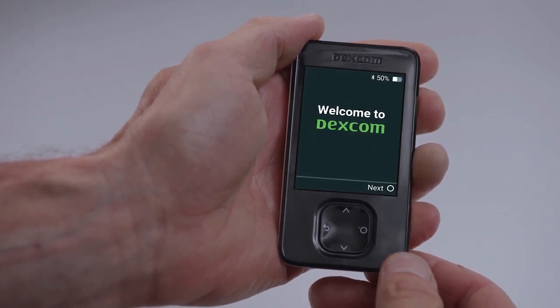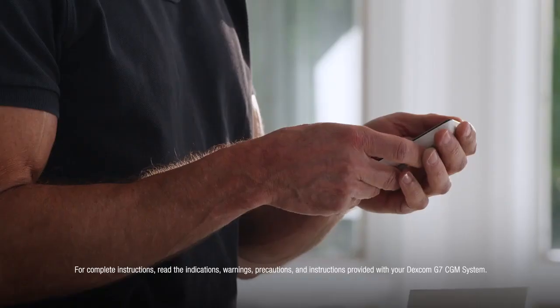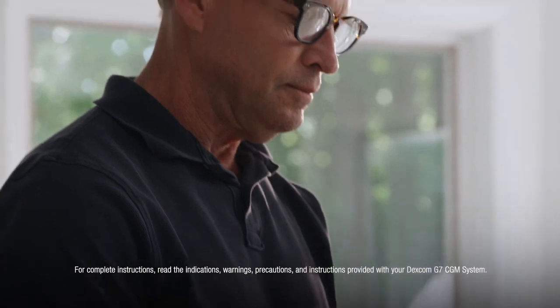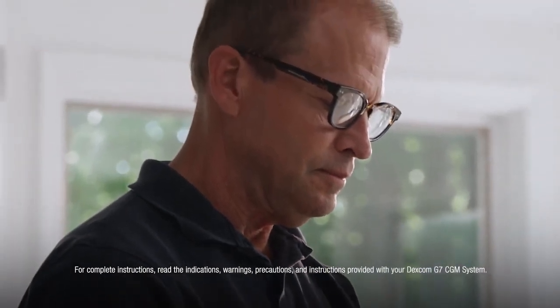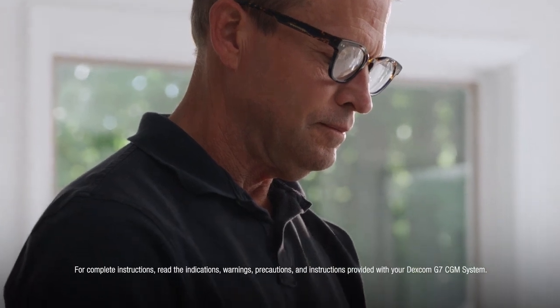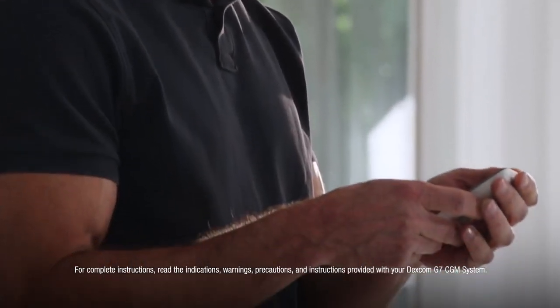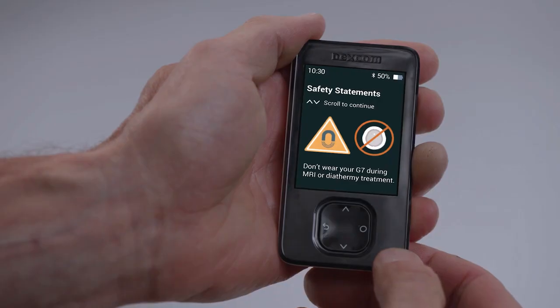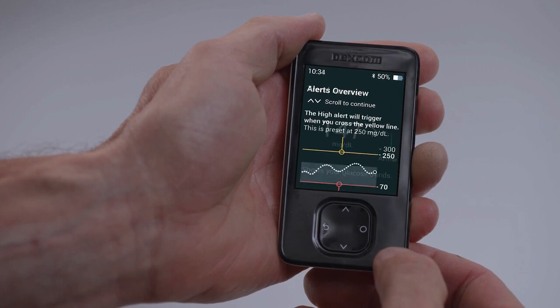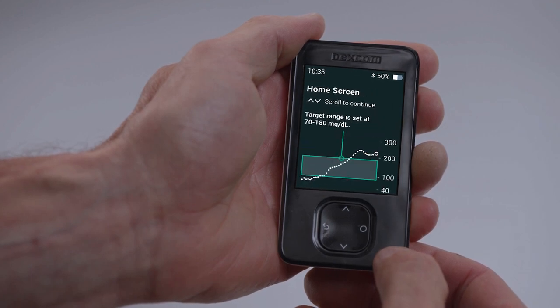Select Next to continue. First, you will accept the Dexcom Terms of Use and Privacy Policy and set your date and time. The receiver will then display a series of educational screens so you can learn everything you need to know about your G7. This in-receiver mini tutorial will teach you all about safety, treatment decisions, trend arrows, alerts, and reading your home screen.